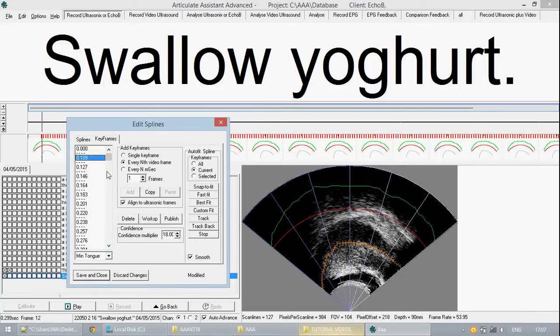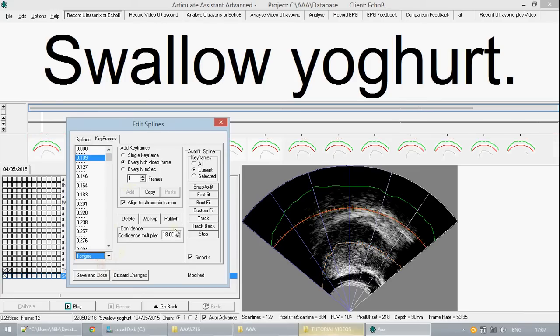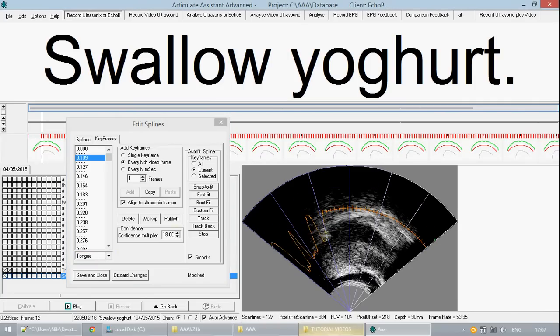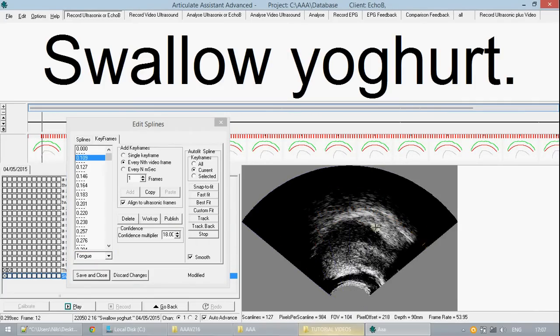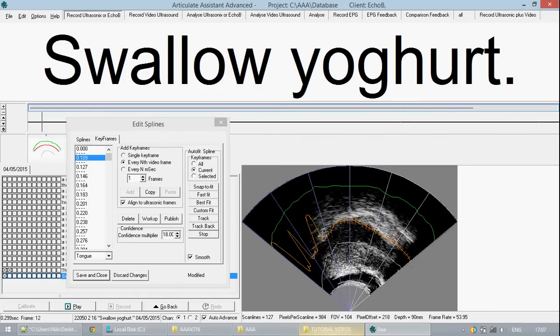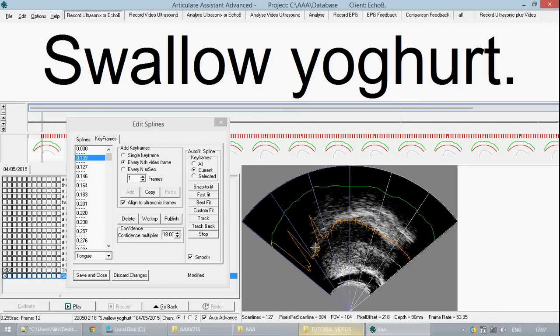What we can now do is when we draw on the contour for the tongue we can then use some options available to allow us to better fit the contour to the shape of the tongue. One such option is snap to fit.